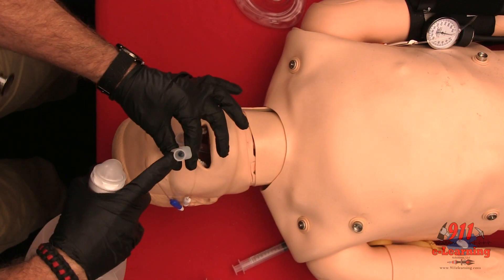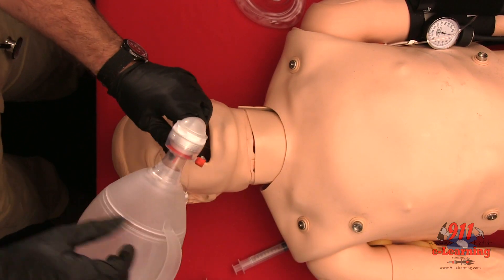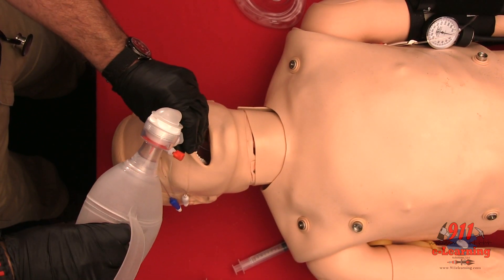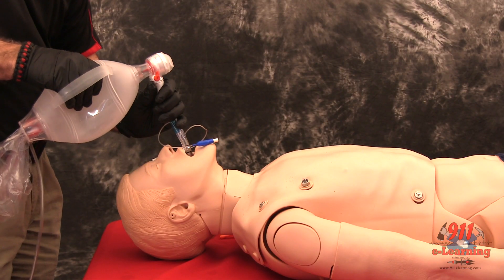Ventilate the patient through the longer blue tube. Auscultate for breath sounds and sounds over the epigastrium. Look for the chest to rise and fall.